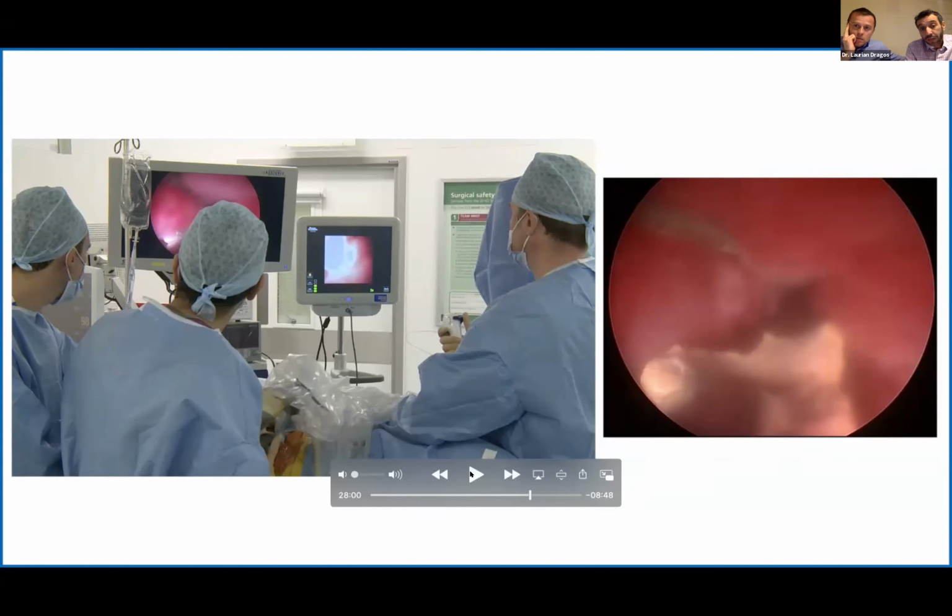So what I was doing there, to begin with, until I got the stone slightly away from the basket, I was using the suction purely. I'm pressing the foot pedal only halfway down to use the suction. And until I was slightly free of the basket, I wouldn't deploy it fully in order to deploy the energy source. Yeah, I encourage you to do it, because nothing happened.